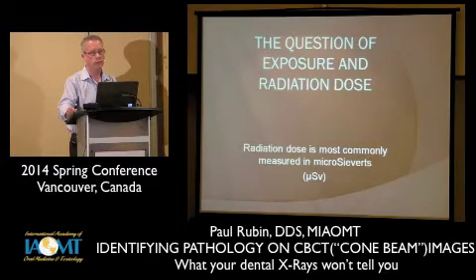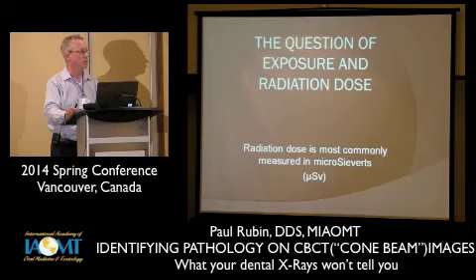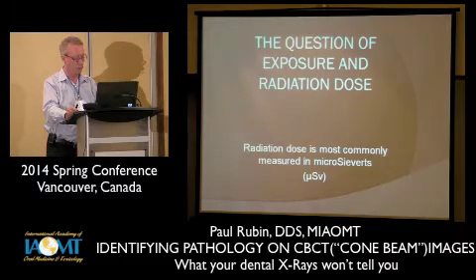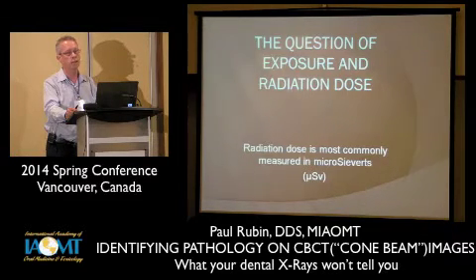We need to address the question of exposure, because your patients will ask that. And I think those of us doing biological dentistry have more patients asking more questions about x-ray dosage than most practices do. So I had a hard time finding good, reliable, objective information about dosage with cone beam x-rays, except for what the manufacturers tell us. So I'm basically relying a lot on what they're saying.